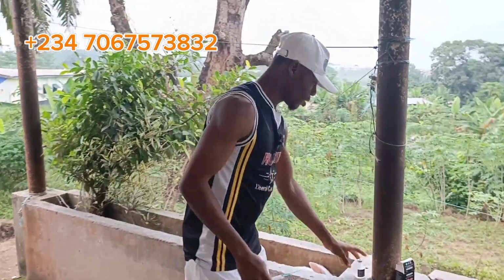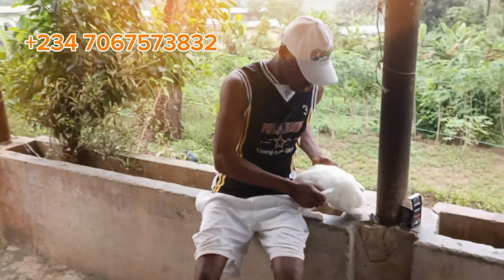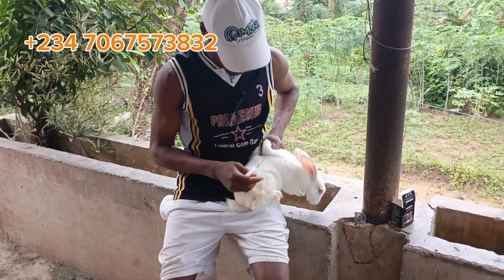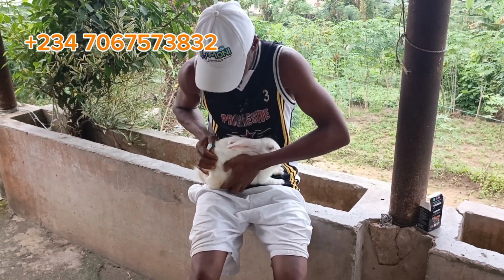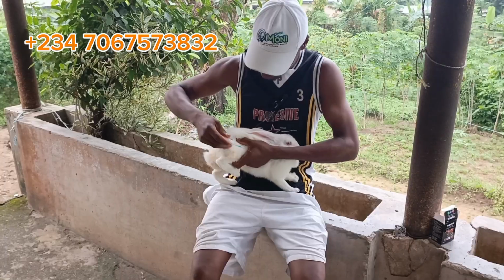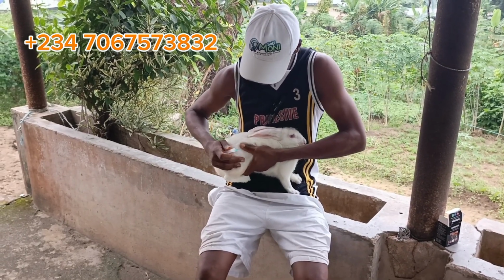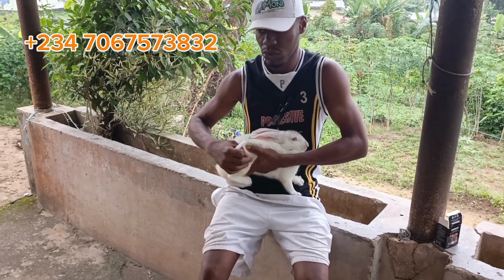Now let's administer this. So this is how you do. You can either use this place or you use this leg. On me, I normally use this part of the body, this leg. Right, so I don't have table here. Table is the best thing to use, but you can use this one. Right, so you just divide this right leg into two and take the upper part. You divide this right leg into two and look for the muscle.